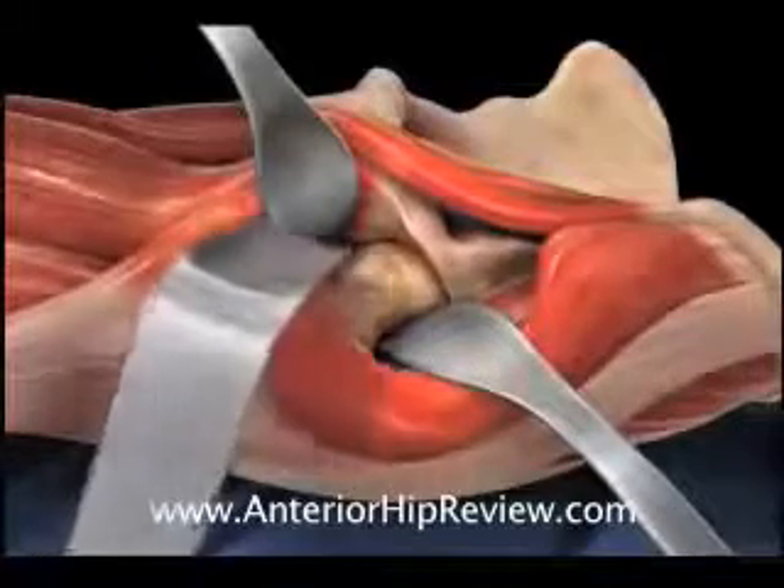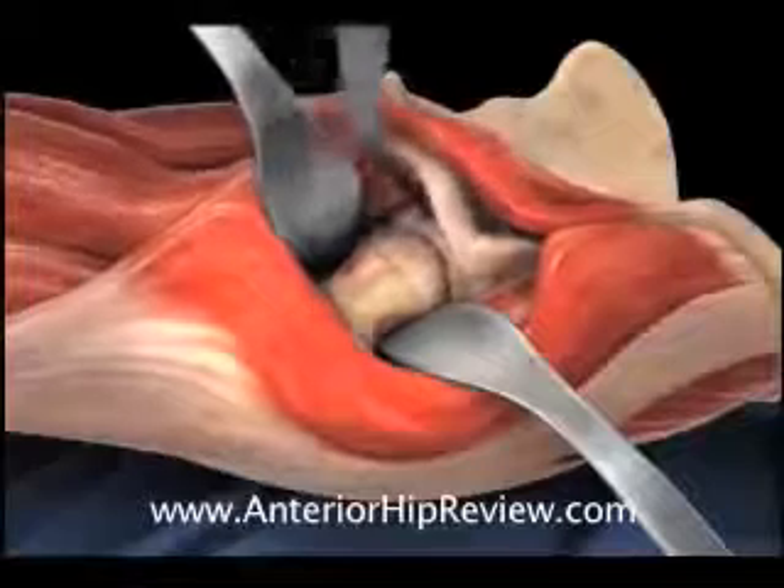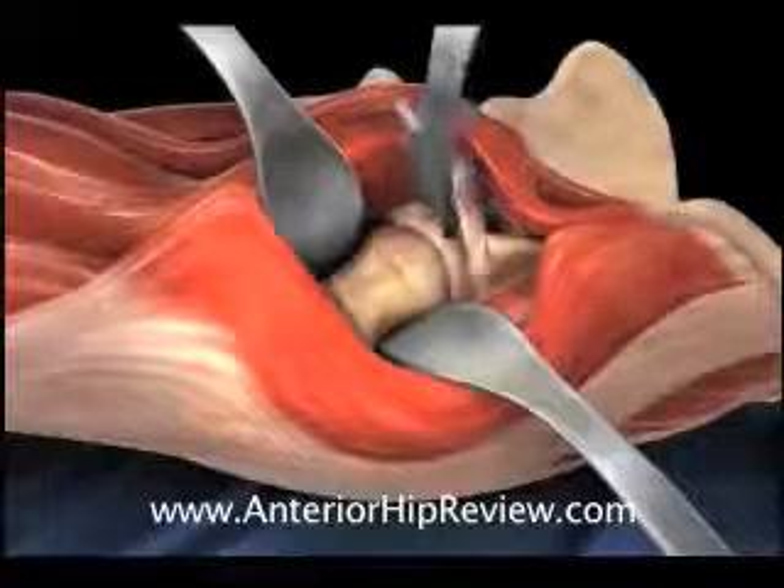Here, a sharp-pointed retractor is placed on the anterior lip of the acetabulum, facilitating removal of the remaining bone spurs around the edge of the acetabulum and the diseased acetabular labrum.